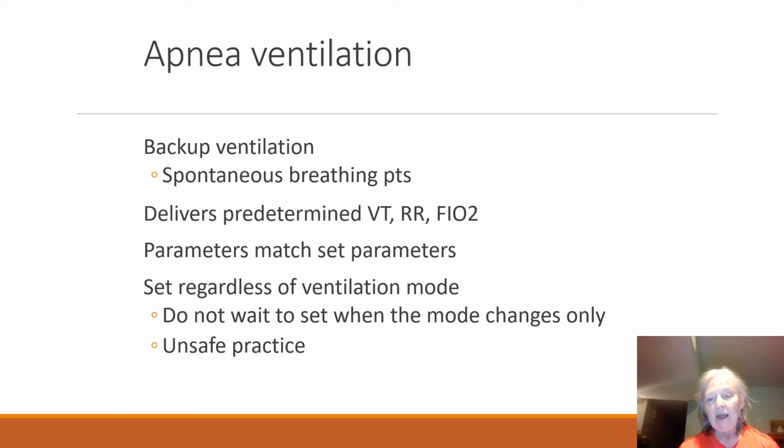One thing to think about, and this is what I tell folks, if you set that respiratory rate, say for example, we were doing something with the patient and the respiratory rate was at 6 or 8 or even 10, you don't want to put that apnea respiratory rate at 6, 8, or 10 because there's too much time in between the breaths. So just leave it maybe around 10, 12, whatever you're comfortable with.